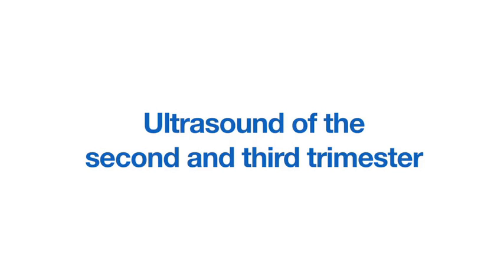This video demonstrates how to set up and perform an ultrasound scan of the second and third trimester.